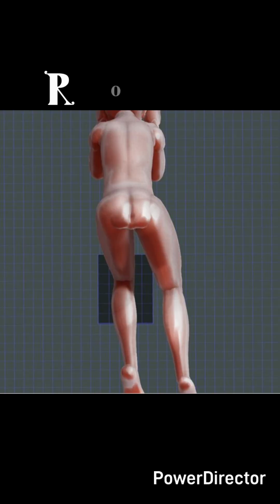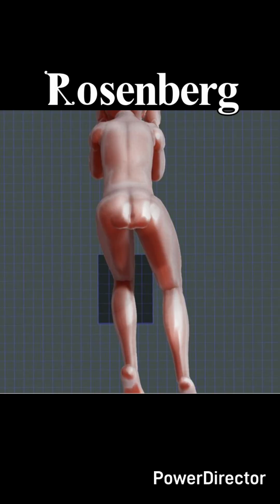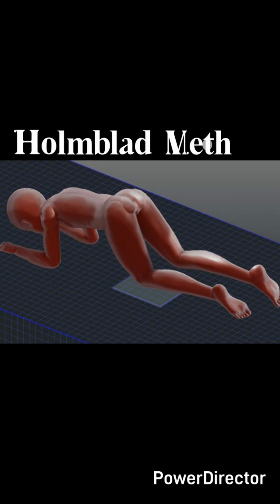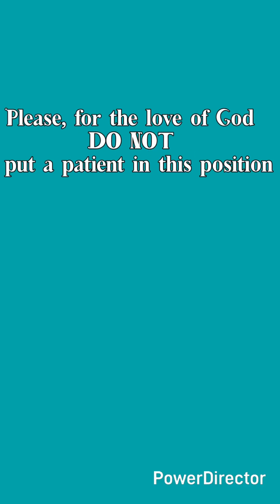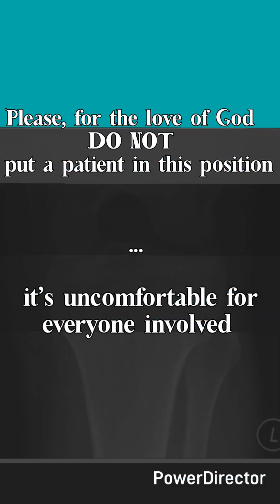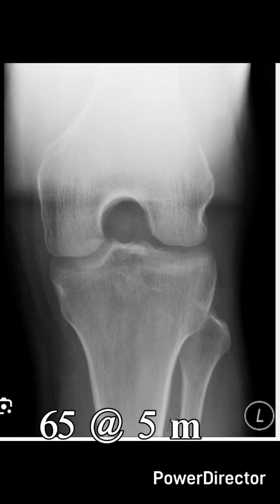The one that I so gracefully demonstrated is the Rosenberg, which is popping up here. We're going to move on. This is what the x-ray should look like. I would shoot this at 65 at 5 for those.